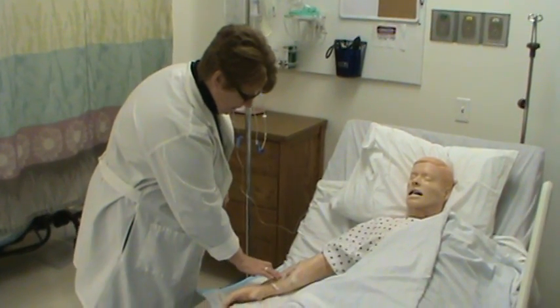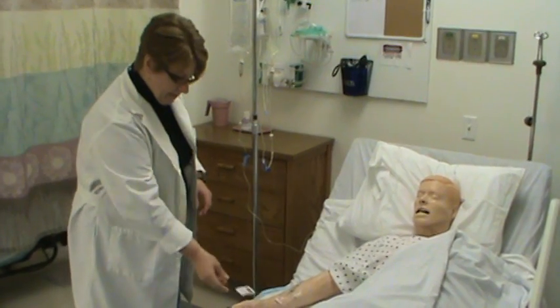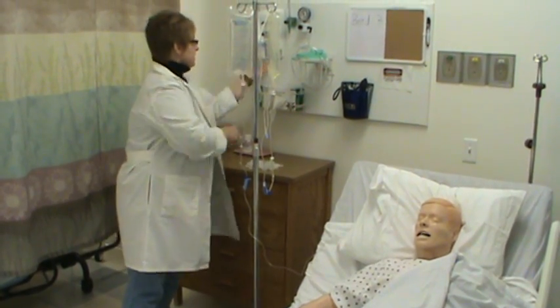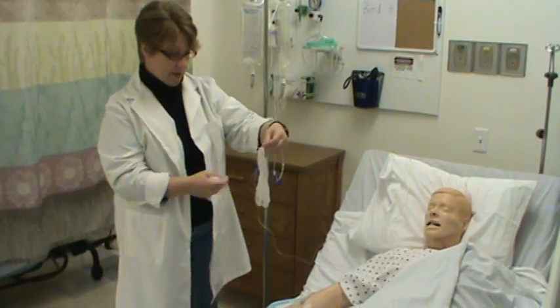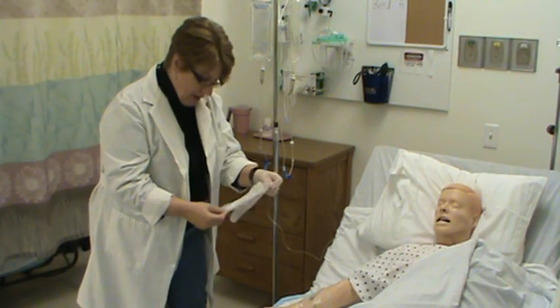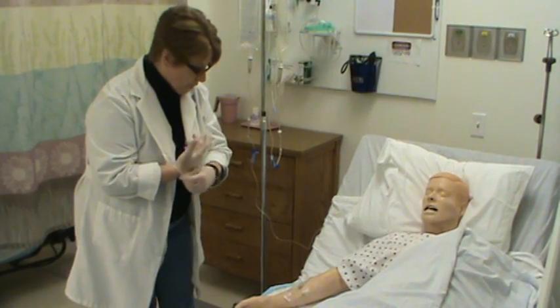So Maritza, thank you. Oops, the arm rolled a little bit. What you would want to do, and anytime you're about to manipulate a patient's IV, you want to put gloves on. So you reach for the gloves, and actually you want to use your hand hygiene because this is a situation that could result in contamination of them as well. So put on our gloves. While I'm putting these on, I want to state to you that the alcohol swab is going to act as a small little sterile field for me in just a second. That's why I brought alcohol with me. And we also want to use it to swab the port.